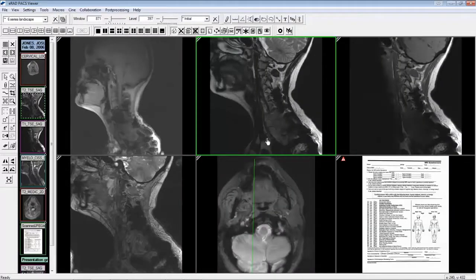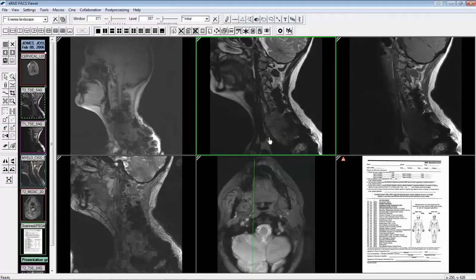The third behavior change has to do with shifting focus from one image frame to another. Previously, the user would have to click on an image frame to shift focus. Now, you simply just have to mouse over the desired image and scroll the mouse wheel to shift focus.